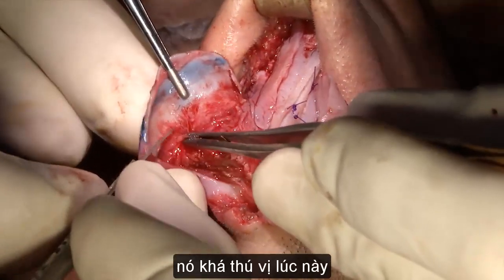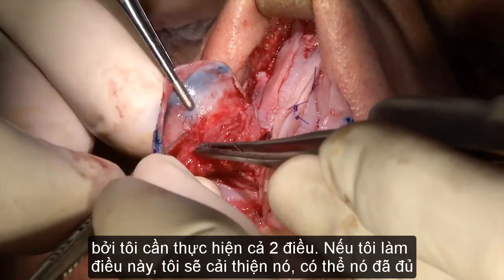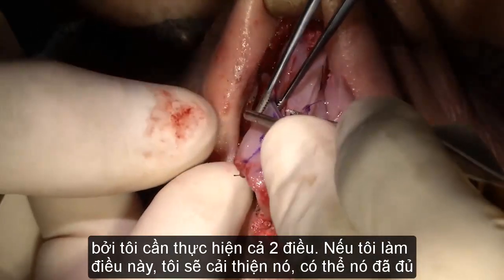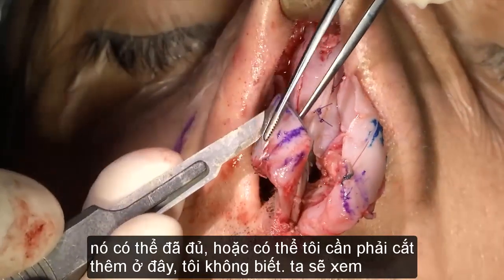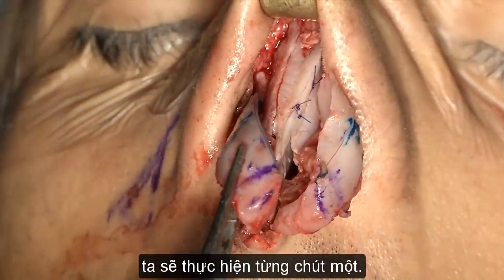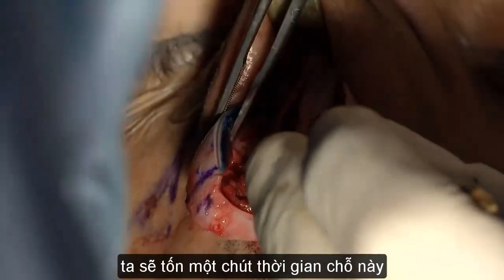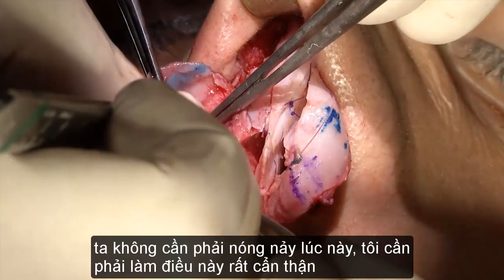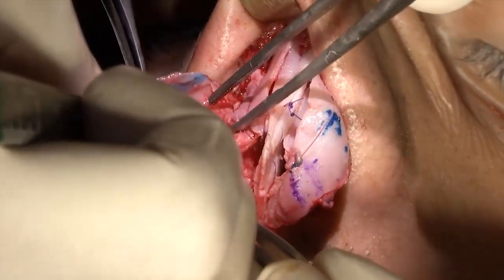Now this becomes a little bit interesting because I have to do both things. If I do this, I'm improving it. Maybe it's enough, or maybe I have to cut here. I don't know. We'll see. We'll go bit by bit. We'll take a little bit of time now, 5-0. So we don't have to be impatient now. We have to do this carefully.